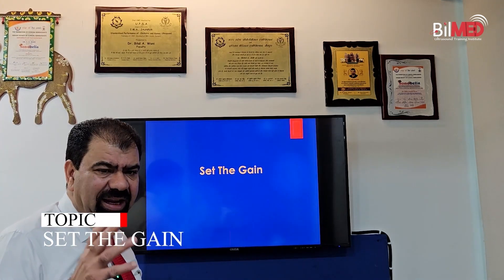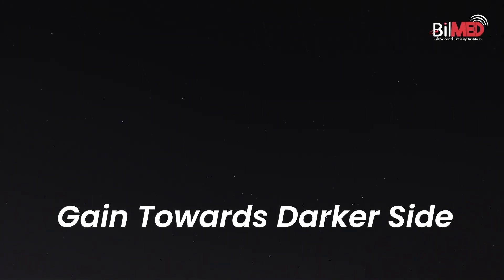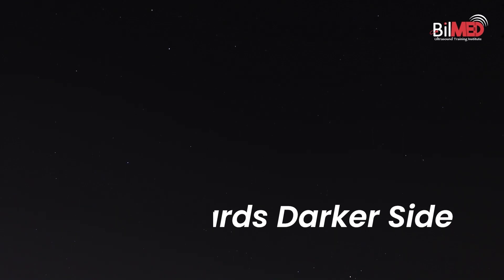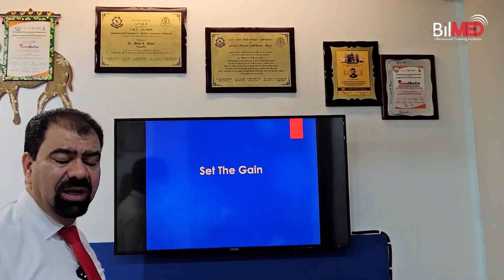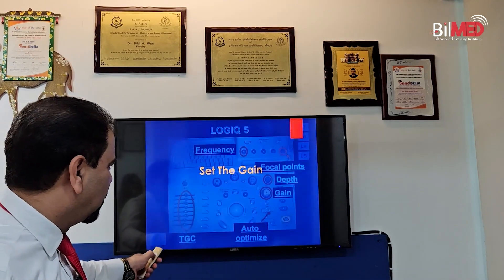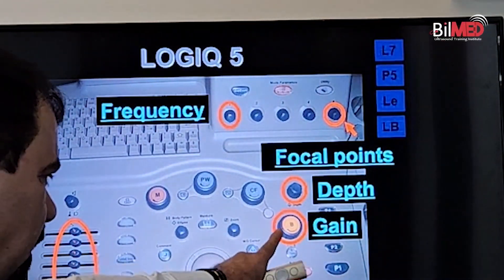Then the gain. How much should the gain be? It depends on the area of interest and what is on the monitor. But here is a clue: the gain has to be towards the darker side. The image should be more dark than white. So check whether your image is more whitish or more darkish — the image should be towards the darkest side, not the whitish side. Adjust your gain accordingly.